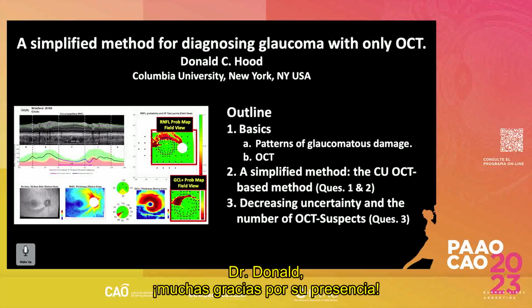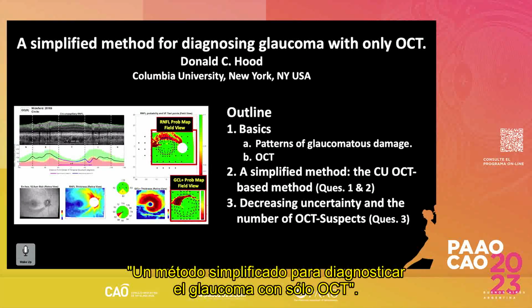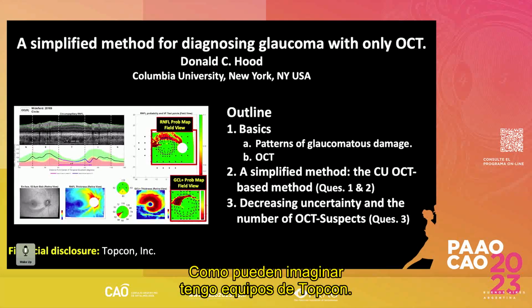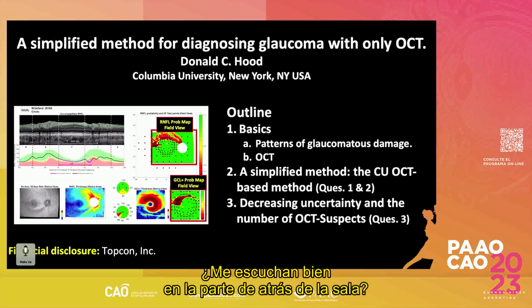So, Don, thank you for being here. The podium is yours. So what I'm going to do is tell you about a simplified method for diagnosing glaucoma with only OCT. And my financial disclosures, since you're here and eating lunch, you can imagine that I have grants and equipment from TopCon.